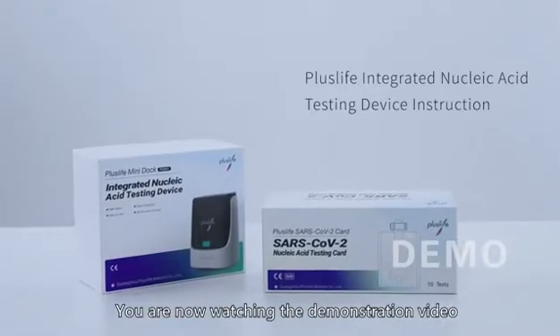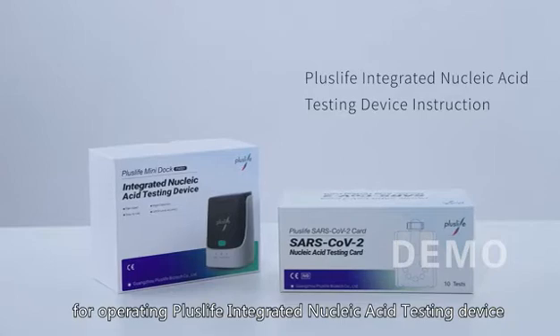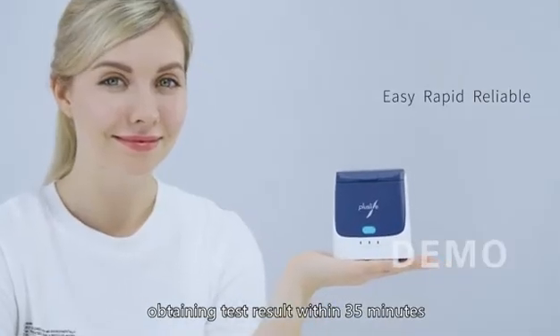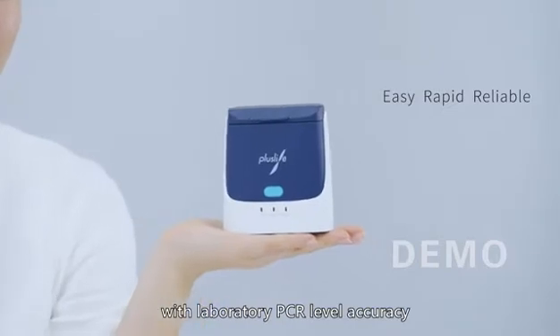Greetings. You are now watching the demonstration video for operating the PLUSLIFE Integrated Nucleic Acid Testing Device. Easy 5-step operation, obtaining test results within 35 minutes with laboratory PCR level accuracy.